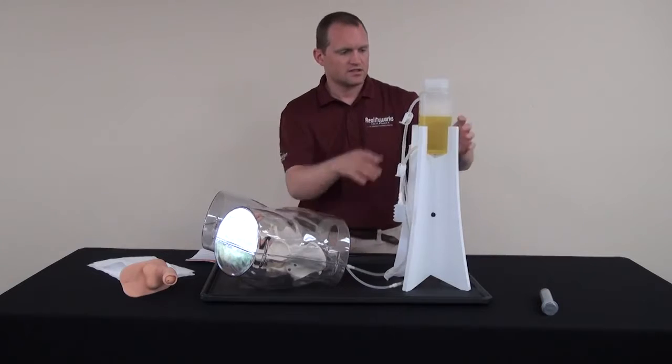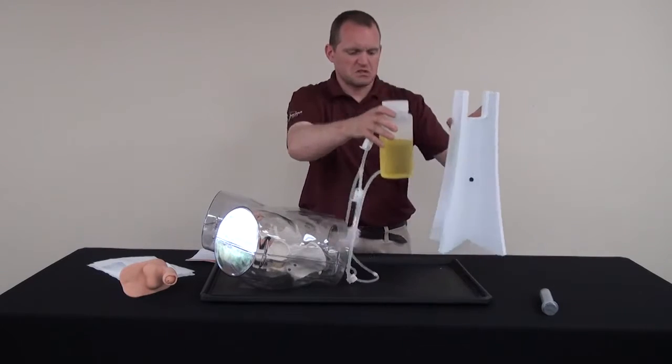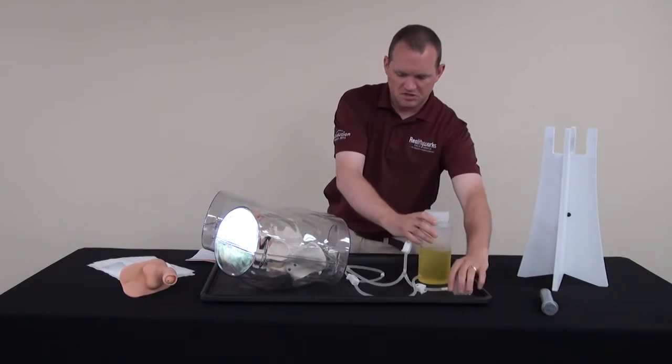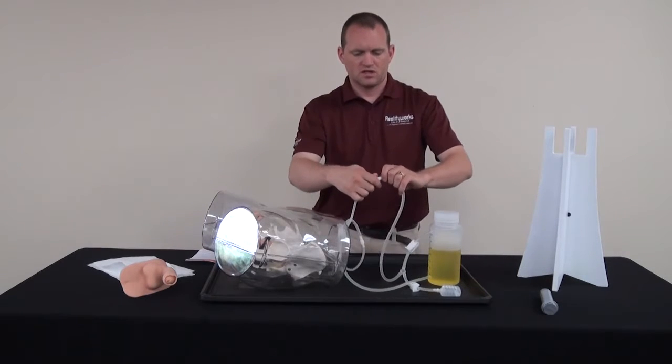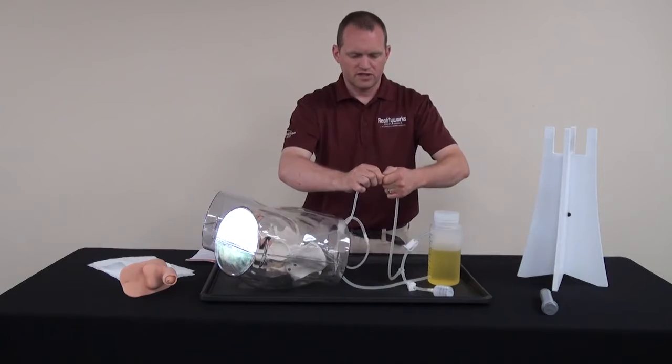And then, can you take this off? Put that down, and then disconnect the luer clamps.